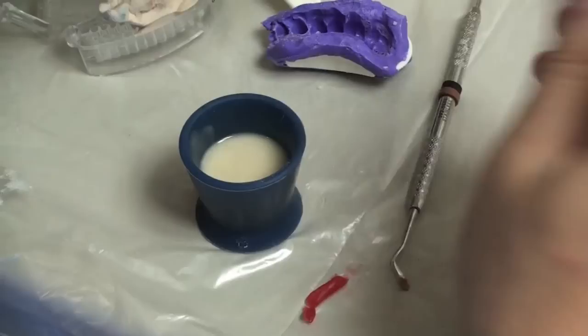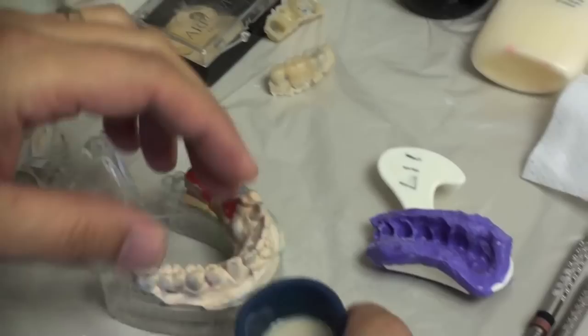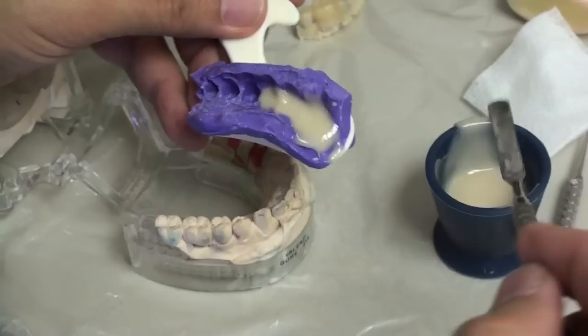Now I forgot to put some Vaseline on here. I'm going to quickly put some Vaseline here so it doesn't get stuck too much. I'm expecting it to get stuck some — obviously in the mouth you would do this only if you had some kind of a composite resin buildup on it. So now I've got my acrylic and it's nice and pourable — pour it in.